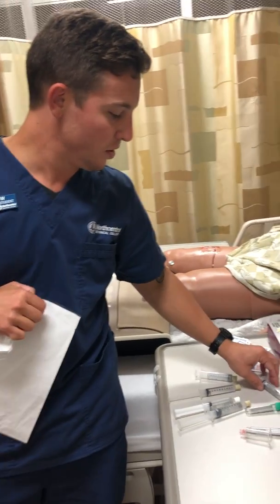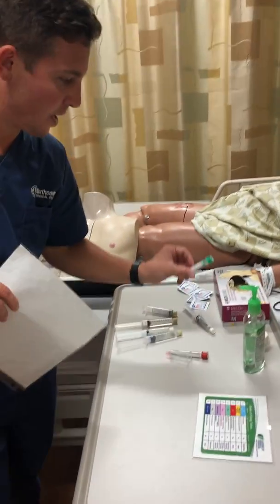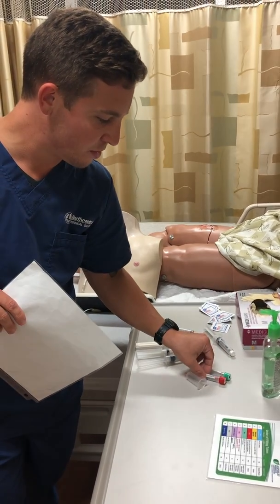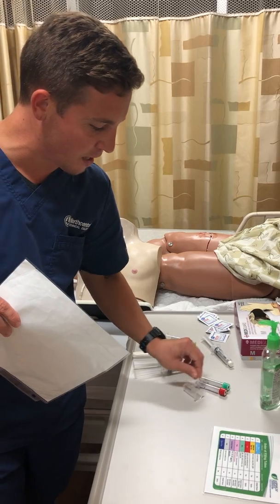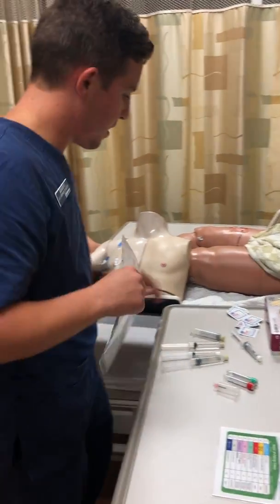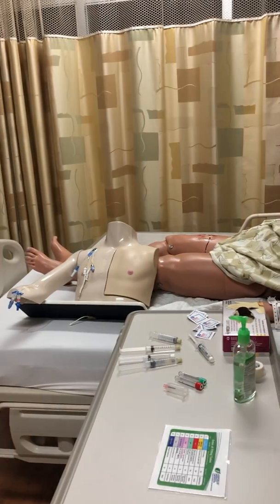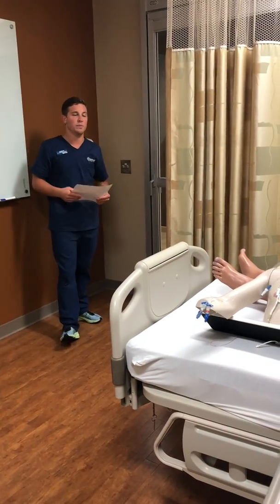Okay, so I also have my lab containers, my vacuum containers here. That's going to collect my samples here, and then I have my transfer device as well. Okay, I have my order of filling tubes right here, alcohol swabs, gloves, tape, hand sanitizer. Alright, so now that I have everything that I need, I can go in and meet my patient.